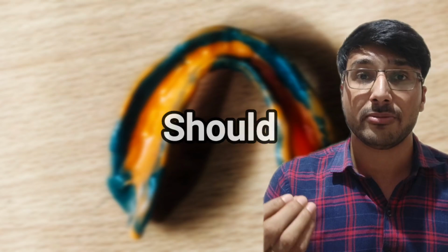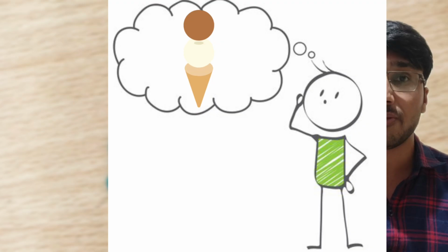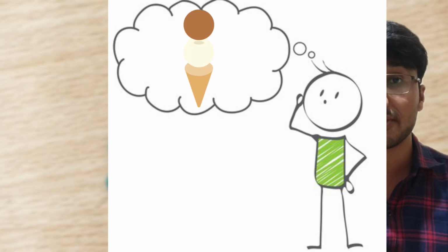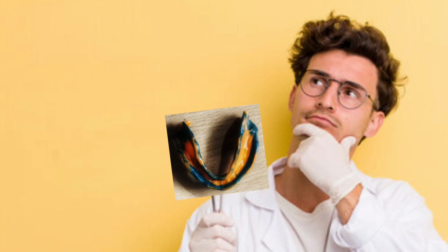Now let's talk about the procedure. You must have heard the phrase, a dentist should make the impression instead of taking the impression. What does that mean? See, whenever we are making something, first of all, we have to have some idea of what we are making. We can't make anything without knowing it. The impression should be in your head before it is in your hand.